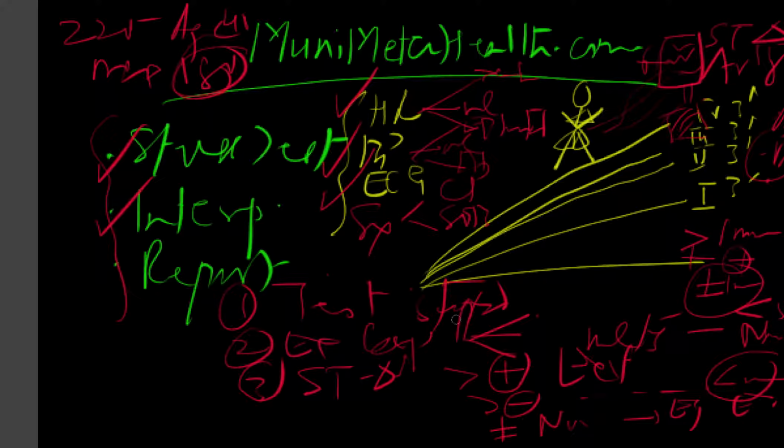So this way an interpretation is offered to the internist and ultimately to the person who is getting the test, because he or she wants to benefit and wants to know whether the test was positive or negative. And if you tell the person the test was non-diagnostic, we don't have any answer to this, you're not getting anywhere. You're still at square one: one, for the physician who referred you, two, for the patient, and three, for your own lab, for yourself, that you're still in a quandary how to manage this patient. So all of these things, and again, we'll discuss how to manage these patients, whether they are positive or negative, in a different video, because that's beyond our video capacity here.